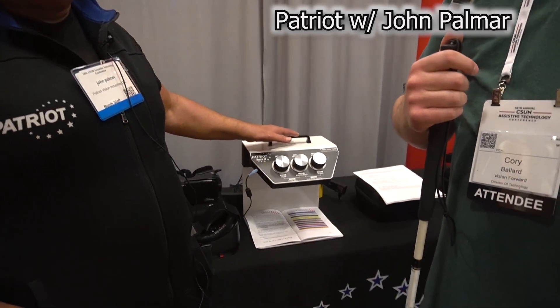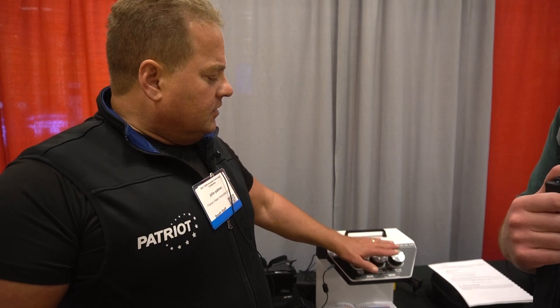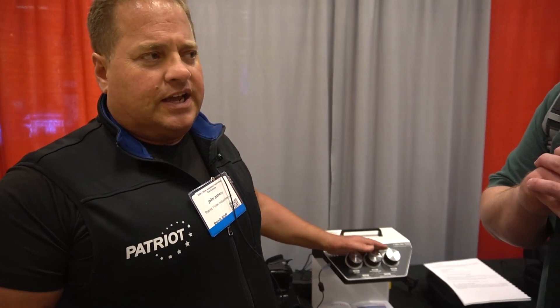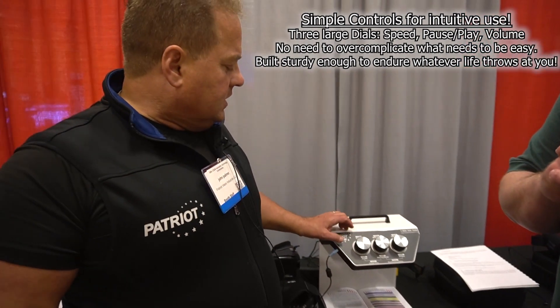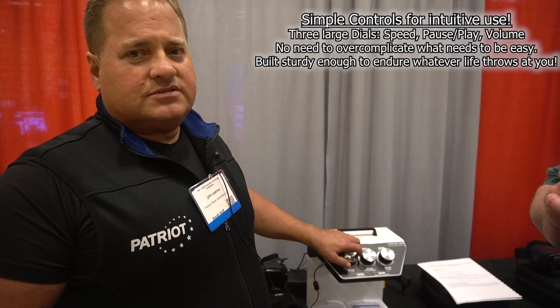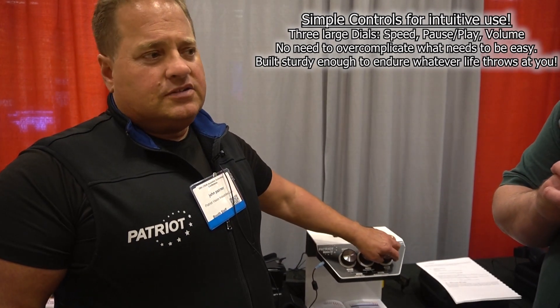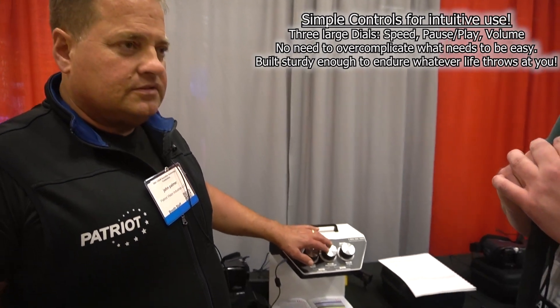Back on the floor at CSUN 2023, we stopped at the Patriot booth talking with Mr. Palmer about the Voice EZ. The Patriot Voice EZ is a standalone appliance — think your toaster, your blender. It does a job for you and does it really well. It has three robust jumbo knobs that are very easy to turn. The first knob is speed — turn it clockwise, it gets faster; counterclockwise, slower. Volume — louder clockwise, softer counterclockwise. And the middle knob is pause and play. It's a video magnifier at 16 to 41 power.